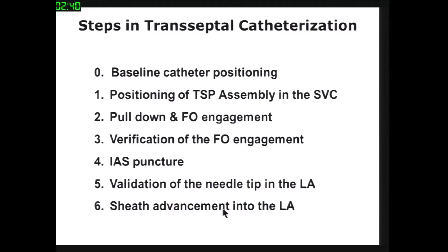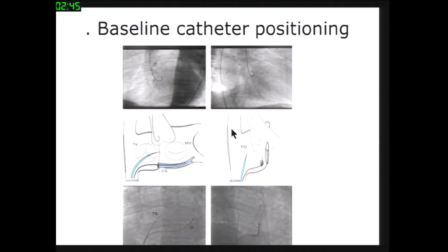For baseline catheter position, for most PMV procedures the catheter is referenced by the trans-aortic pigtail, which is located at the aortic area in both the AP and lateral views. The fossa ovalis is localized in relation to these landmark views.